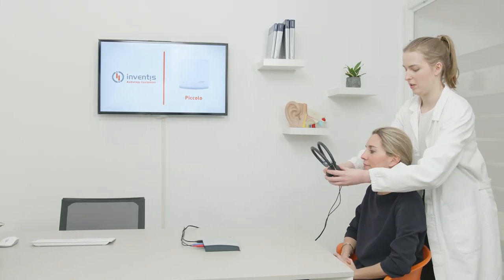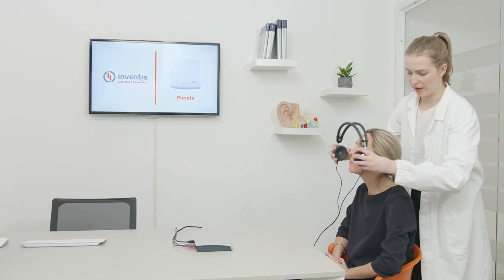The Piccolo series carries out a wide range of audiology testing. To best fit different needs, Piccolo comes in three versions: basic, plus, and speech.